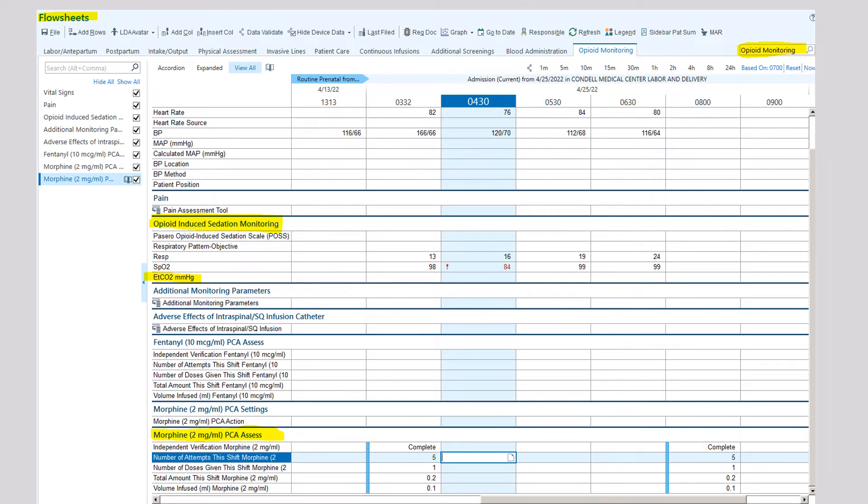For documentation in the flow sheet, you want to go to the flow sheets, type in opioid monitoring on the left, on the right hand side. And then make sure that you complete the opioid induced sedation monitoring, the ET CO2.